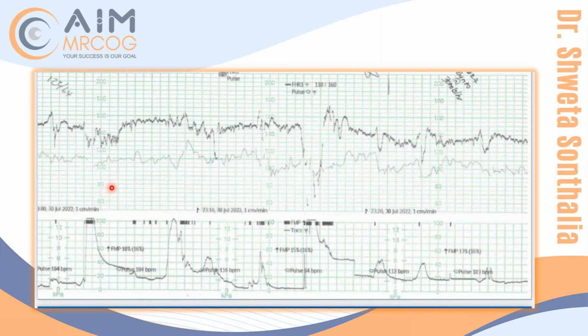As I told you, most of the time, as overseas candidates, we hear from our nurses that it's early deceleration because it is coming with contraction. But actually it doesn't fit into early deceleration criteria, because variable can even come with contraction, right? Am I making sense? So try to fit every deceleration into variable deceleration, and unless you can't fit into that, stick to variable. So the first choice should be variable. And if you think no, it is not fitting variable, all are looking similar, all are coming with contraction, ending with contraction, all having a similar pattern, then it becomes early or late accordingly.